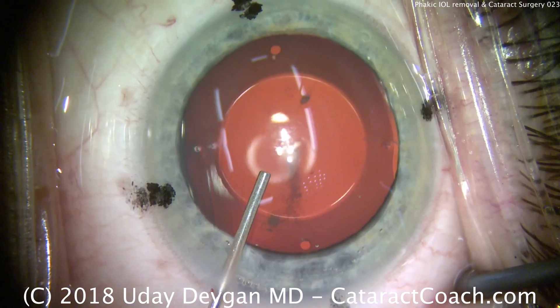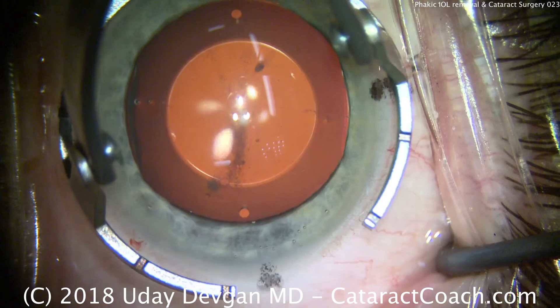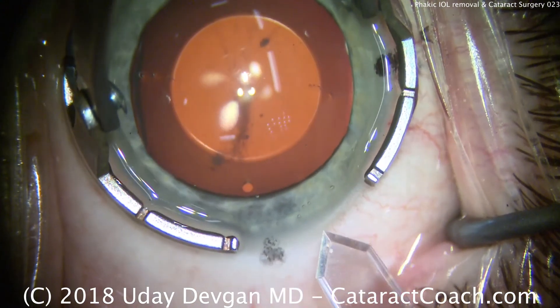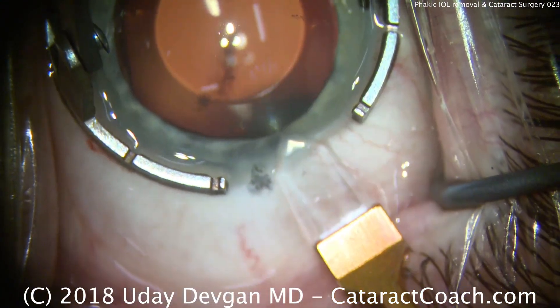We'll fill the eye with viscoelastic here. We're going to be able to treat the entire refractive error with just one IOL — remove the cataract, which of course has power, remove the phakic IOL, and just implant a single toric lens in this case.